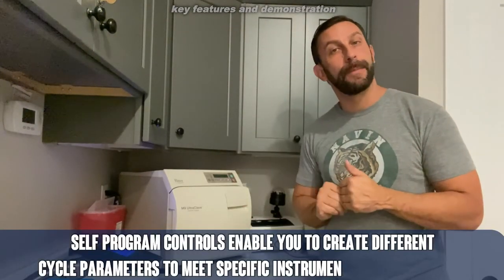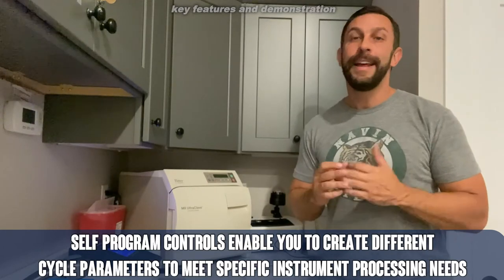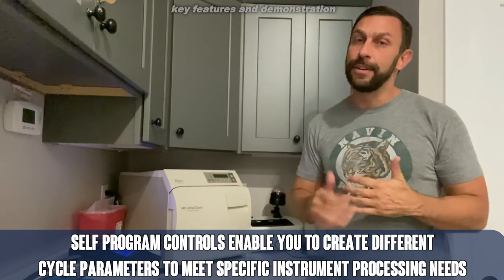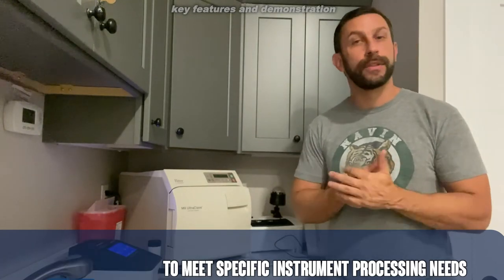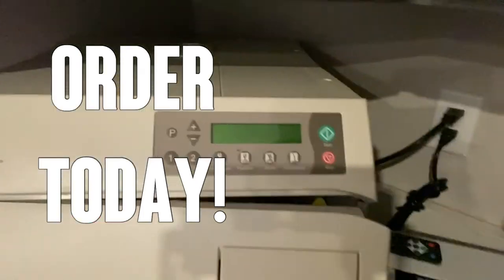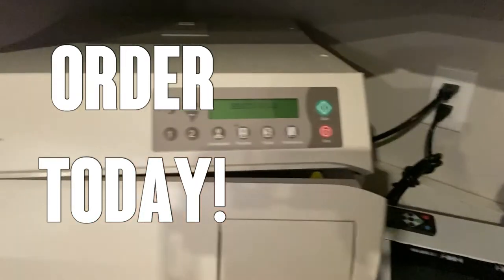It's got an easy green start button, red stop button, and there's not much to it in terms of training staff to do this. Easy to use, comes with an instruction manual, easy to set up, and it's ready to go. So you're going to want to pick this up today — order today, you won't be disappointed.